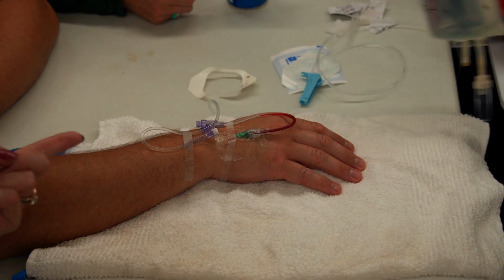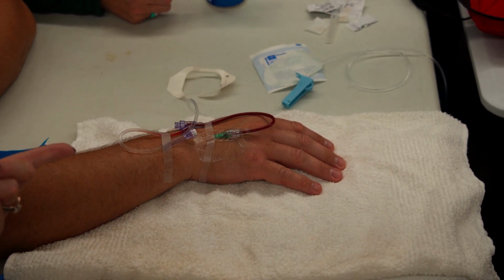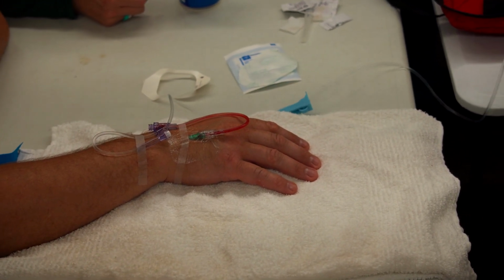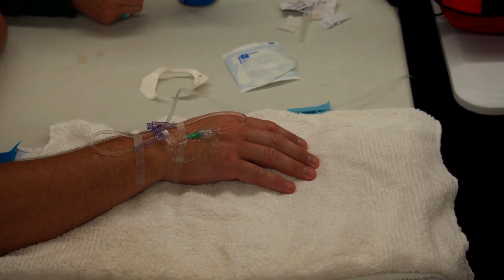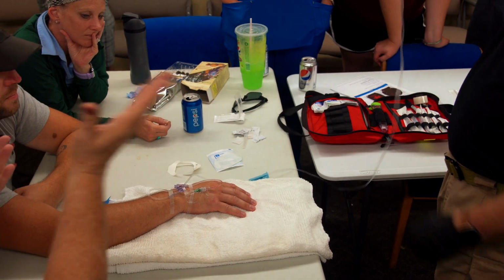Oh, see? Oh, hey, there we go. That's blood. Oh my God, I must have screwed it up because we put the bag gravity the wrong way. There we go. I'm kind of glad you did that. I saw that going to the hospital sometimes, so they just throw the bag out. That's why you always have it up.